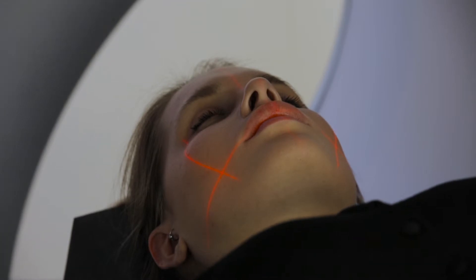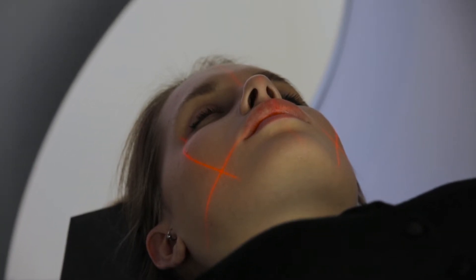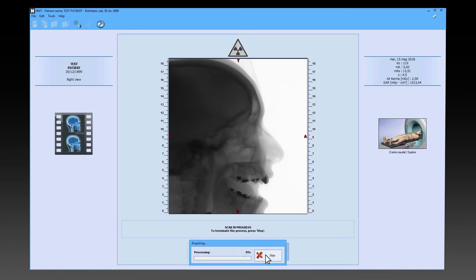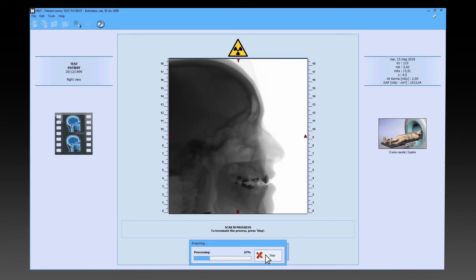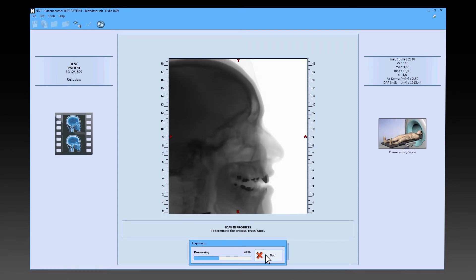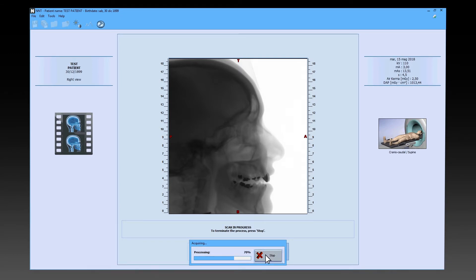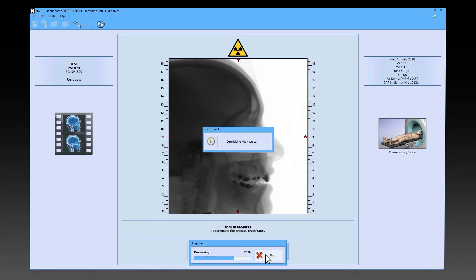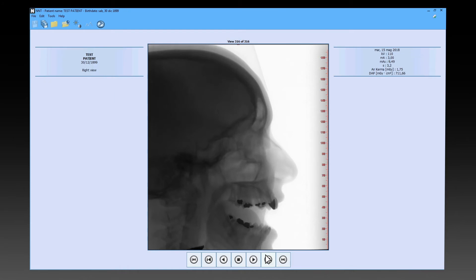During the scan, ask the patient to remain still as required. The scan will start immediately and a progress bar will show the scanning percentage. Scanning can be interrupted at any time by pressing the stop button, and the images obtained until then will be saved in any case.